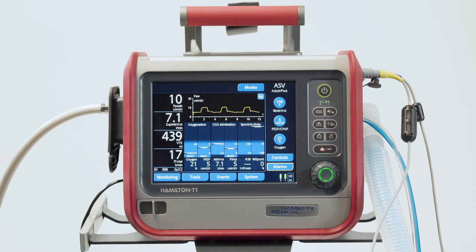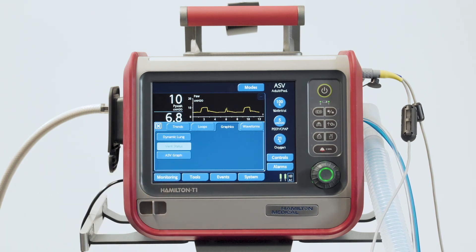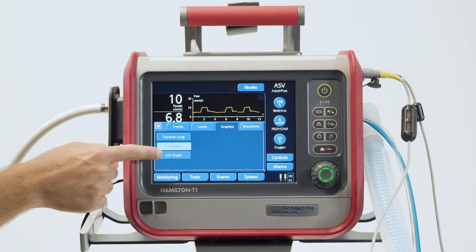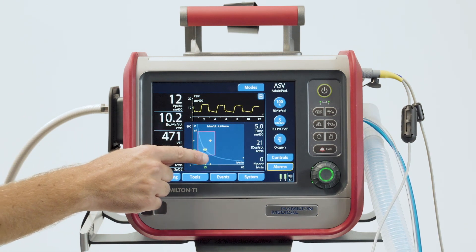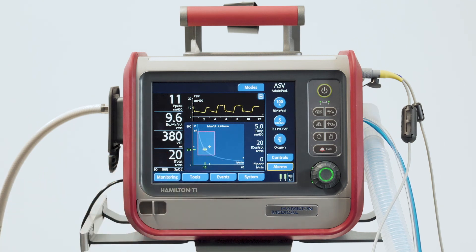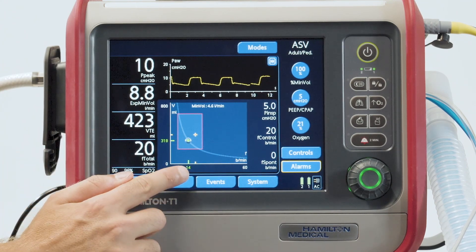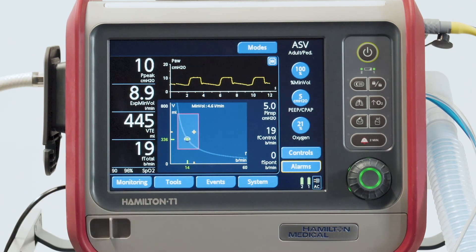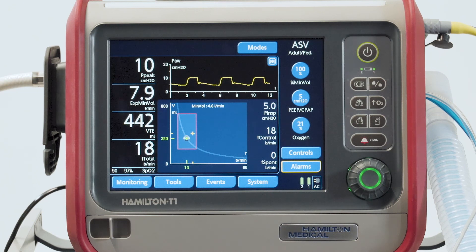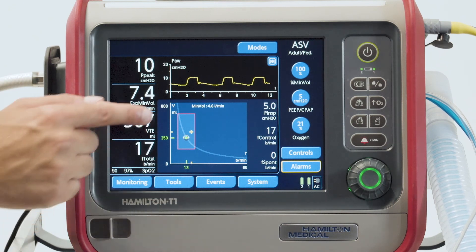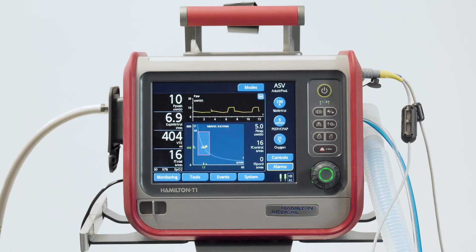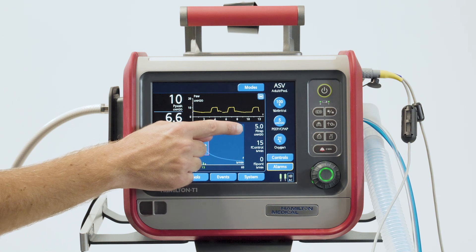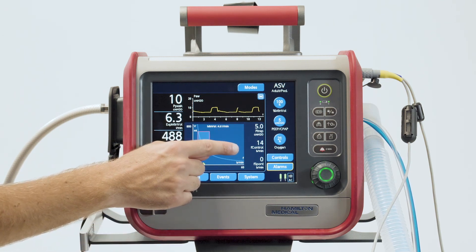Both panels are available in all ventilation modes. If you select the ASV mode, there's another intelligent panel you can display — the ASV graph. Touch the graphic area of the display, then touch the graphics tab, and select the ASV graph. The ASV graph shows you the patient's current minute ventilation target, together with the target and real-time values for tidal volume and frequency. You can see how the adaptive lung controller moves towards its desired targets. The graph also has a safety frame showing the limits within which the target point should move. This panel includes real-time values for the applied pressure and the total and spontaneous respiratory rate.